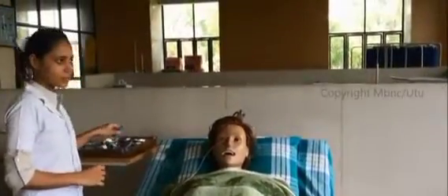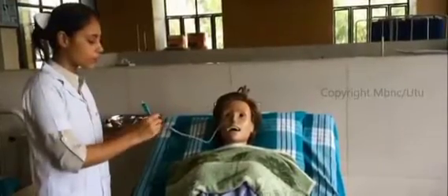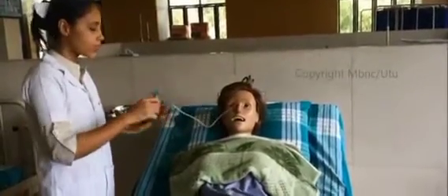The third method of NG tube placement confirmation is that we aspirate the stomach content, or the gastric content. For that, we first pinch the NG tube, and then connect the tip of the syringe to the base of the Ryle's tube. Then we open the pinch and open the Ryle's tube. Then we withdraw the gastric content, which we consider as aspiration. Slowly we have to withdraw.